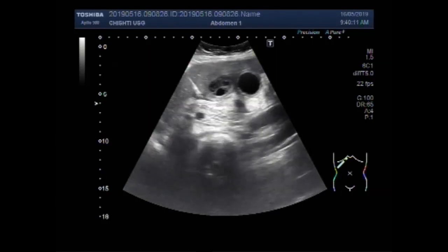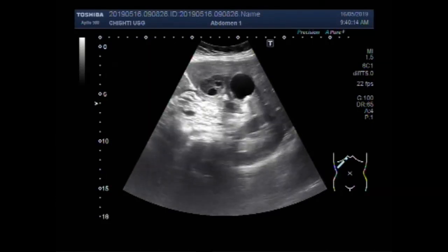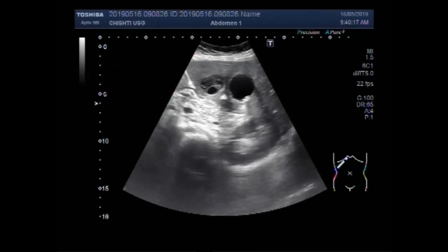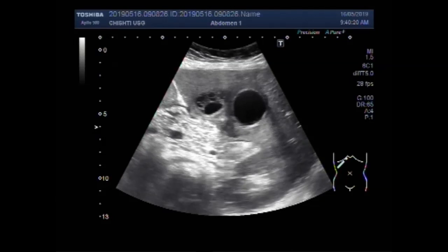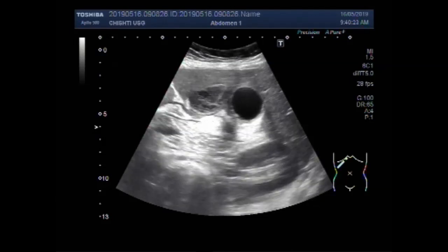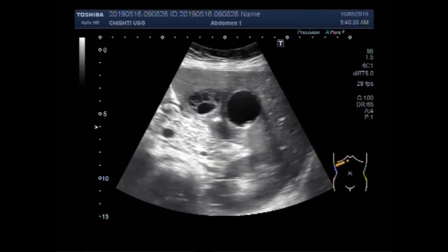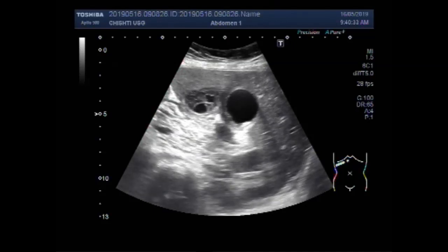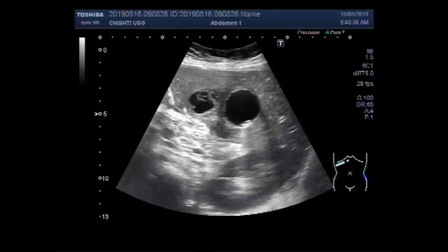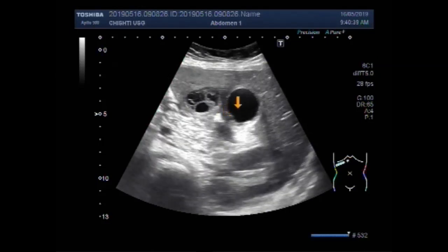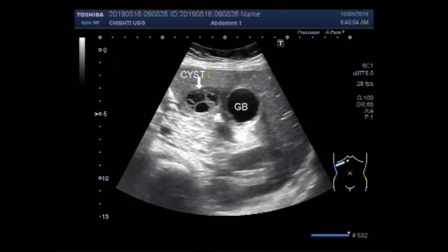Now you can see a cystic mass, which is probably an amoebic cyst, lying adjacent to the gallbladder. The amoebic cyst is round to oval in shape, having multiple internal echoes and triple internal septa. This is the cyst which is probably an amoebic cyst.